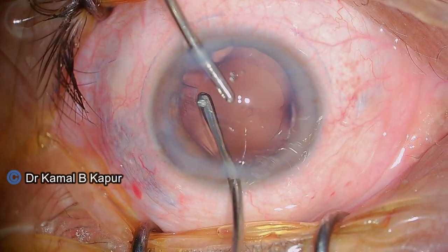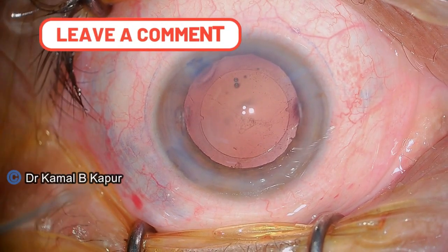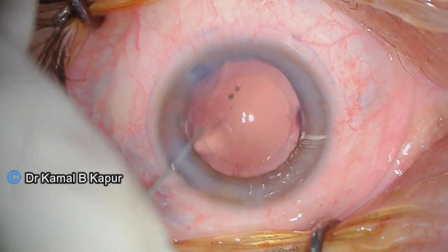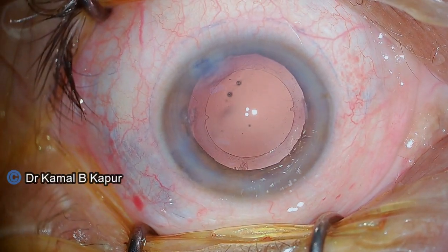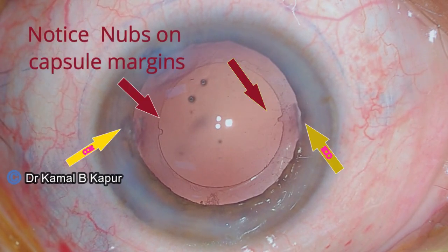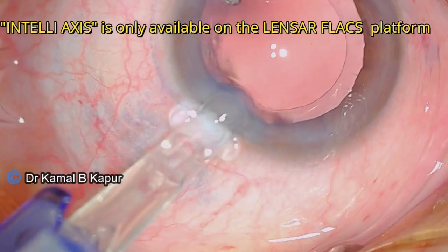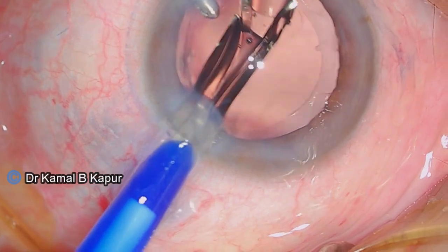As we do that, you can clearly notice the IntelliAxis nubs which have been created by the femtolaser machine to give the exact positioning for placement of the toric IOL. You can see the clear nubs on the capsule rexis margin along with the arcuate CCIs created to compensate for the lower toricity power of the available IOL.